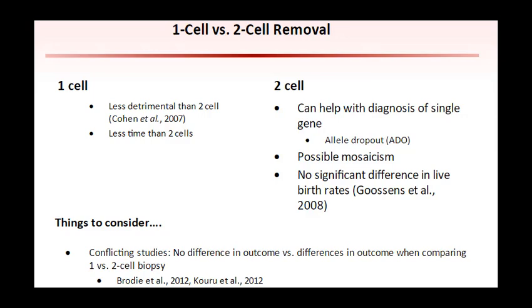It is difficult to determine the exact effects of the removal of 2 cells. These typically are removed from more progressed embryos, 6 to 8 cells, whereas the biopsy of 1 cell is performed on less progressed embryos. There are multiple observational studies that show conflicting results. Some found no significant difference between cell number and embryo progression, while others did show a difference.